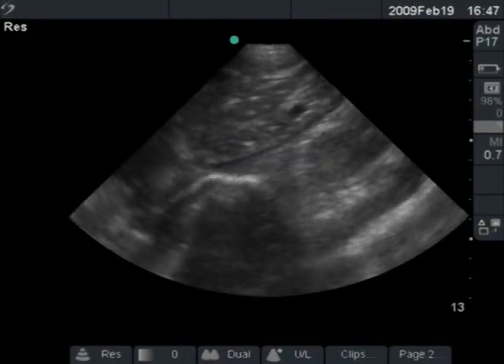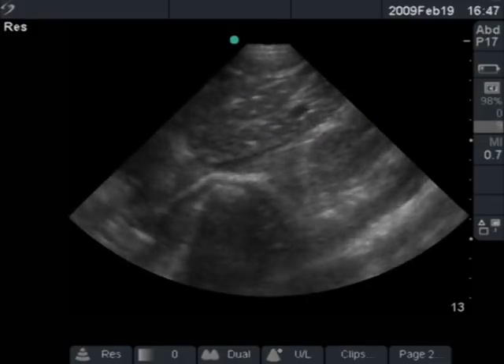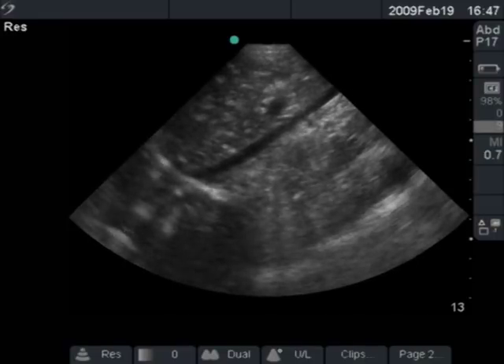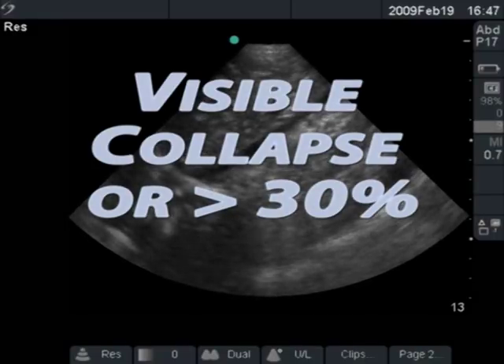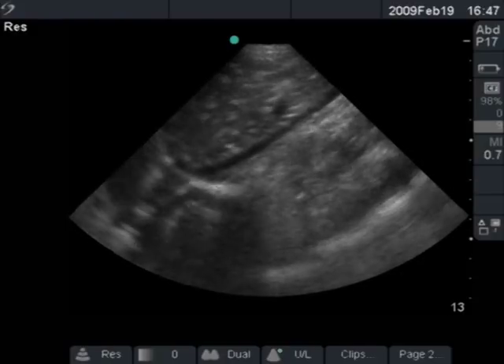This IVC is collapsing nearly completely. Anything greater than 50% collapse means the patient is going to be responsive to fluid — that's the most validated number. If the IVC collapses more than 50%, give them fluid. Even if it's greater than 30%, which you can easily see with your eye, you would probably give them fluid. So if you're seeing any significant collapse, the patient needs fluid.